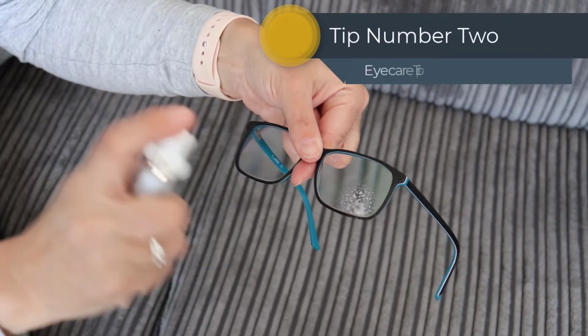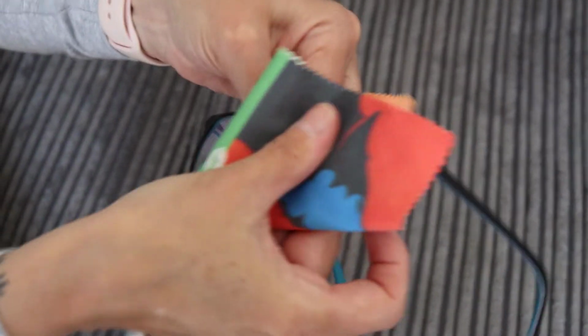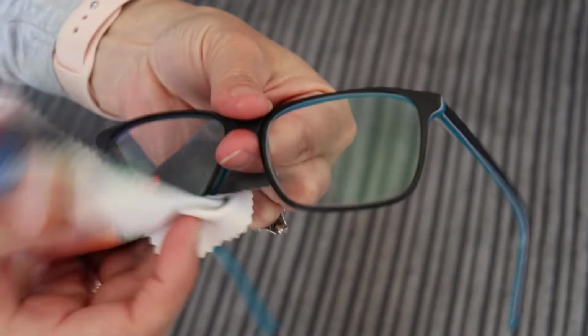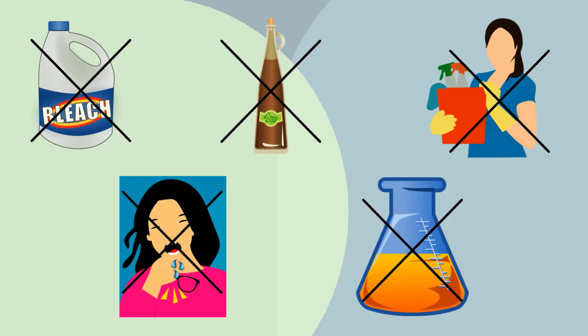Tip number 2 is to clean your lenses with a lens cleaner specially designed for spectacles. Don't dry wipe, as debris or dust can scratch the lens if rubbed directly with a cloth, and certainly don't use bleach, vinegar, household cleaners, spit or any other chemical, as these can tear off special lens treatments.